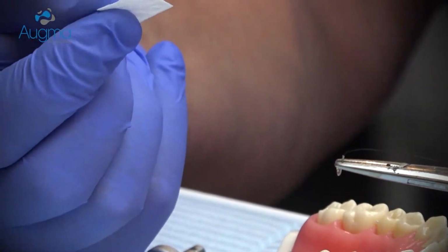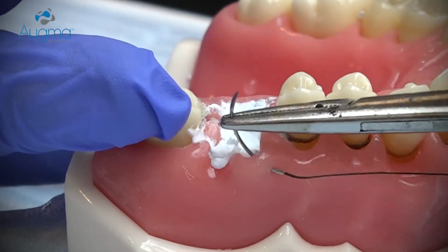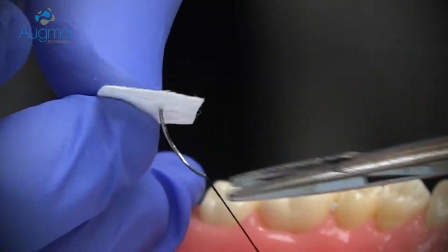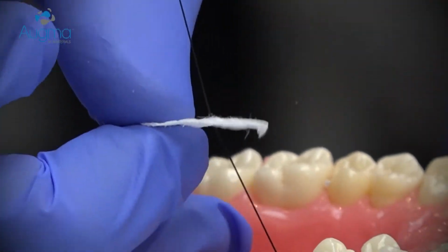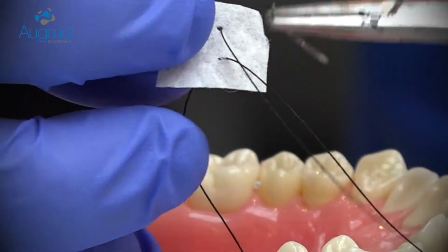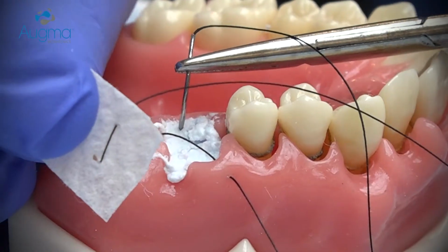Hold the collagen sponge in your hand, insert the needle from the buccal aspect, insert it to the bottom of the collagen sponge, and from up to down, insert the needle into the lingual aspect.